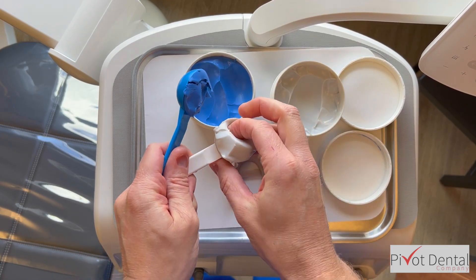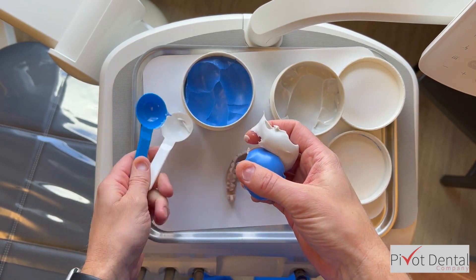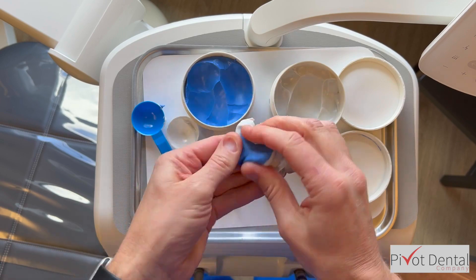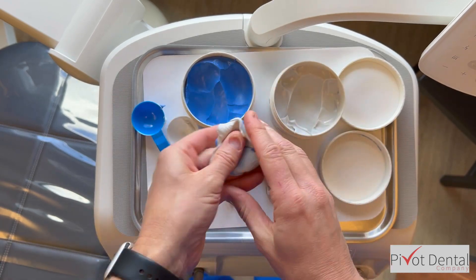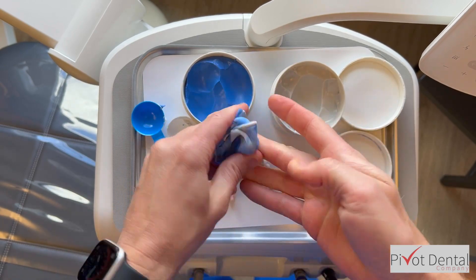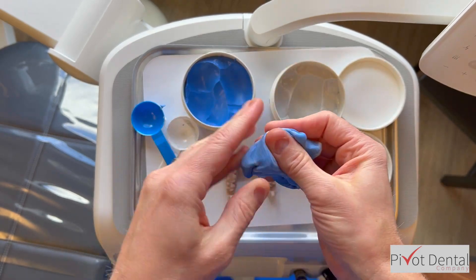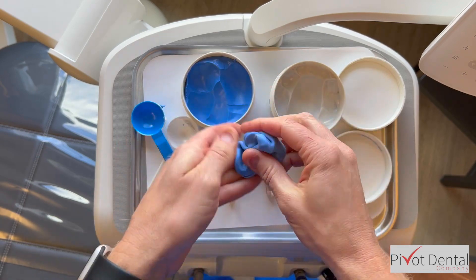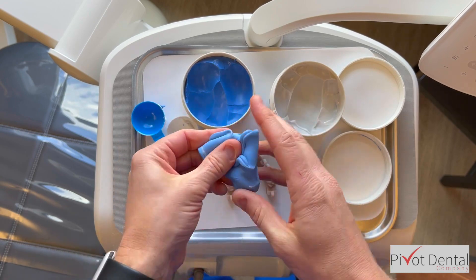Then you simply mix them together — a pretty simple process, just like mixing play-doh. You have about 45 seconds of working time to get this together before it starts to set up. Mixing the blue and white takes about 20 to 25 seconds to get it to a completely homogeneous mix, just working it back and forth.